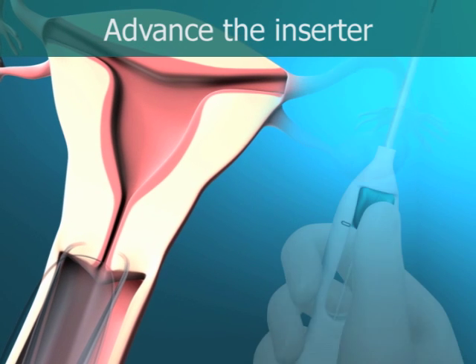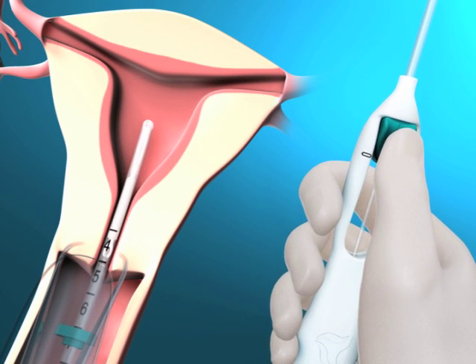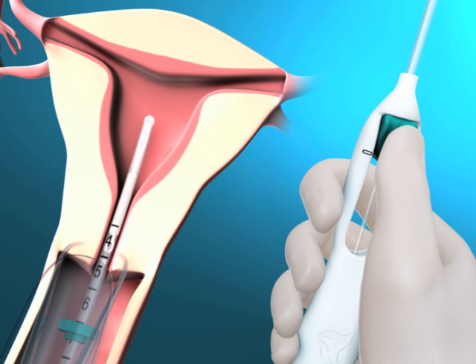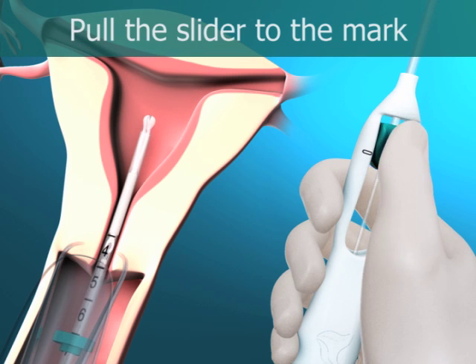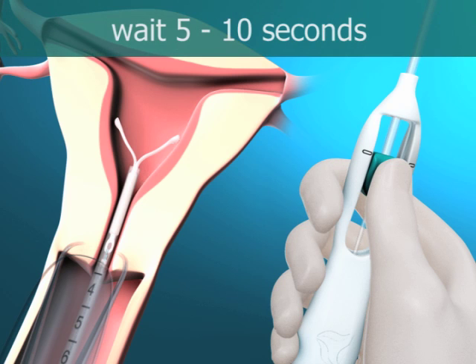While holding the slider in the furthest position, advance the inserter through the cervix until the flange is approximately 1.5 to 2 cm from the uterine cervix. Do not force the inserter. Dilate the cervical canal if necessary. While holding the inserter steady, pull the slider to the mark to open the horizontal arms of Mirena. Wait 5 to 10 seconds for the horizontal arms to open completely.